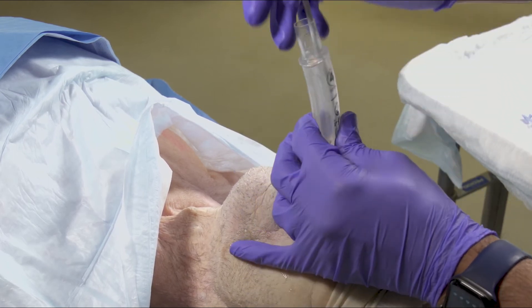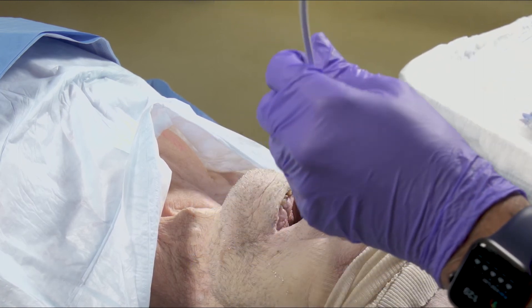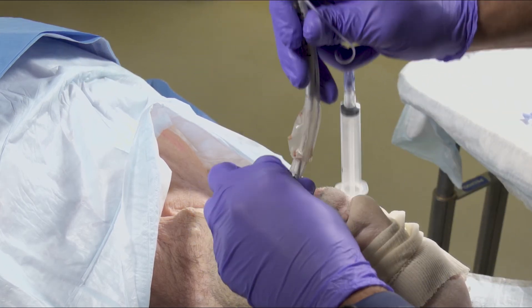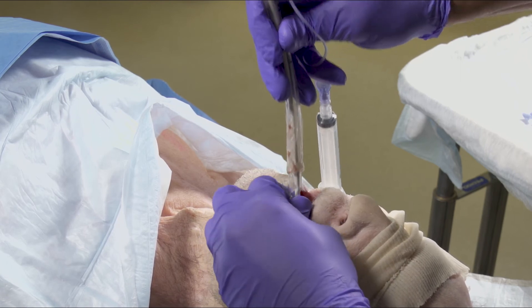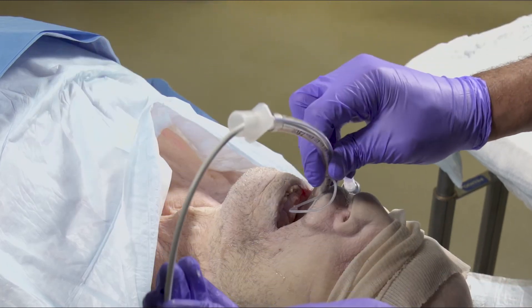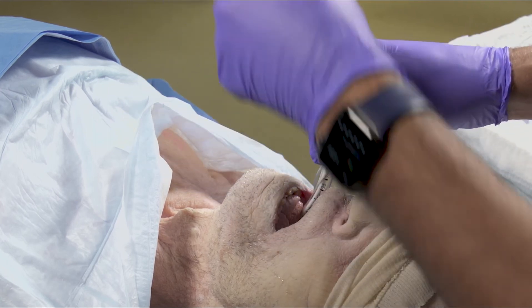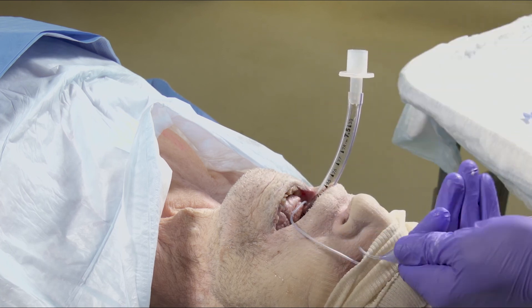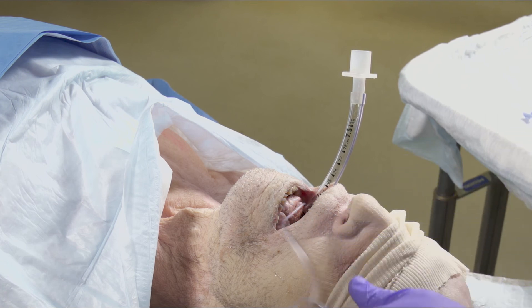Remove the bronch adapter, then slowly remove the iGel while keeping the white scope tubing in the trachea. Consider using a laryngoscope to lift soft tissue out of the way. Insert the endotracheal tube over the bronchoscope like a bougie into the trachea. Confirm placement with end tidal CO2 and auscultation, and secure your tube.